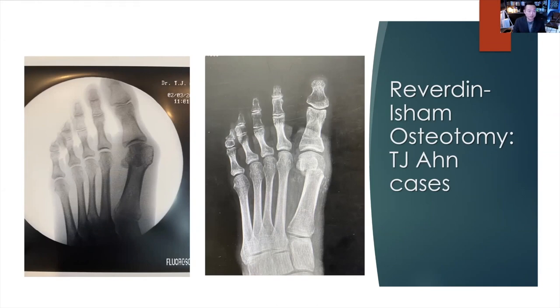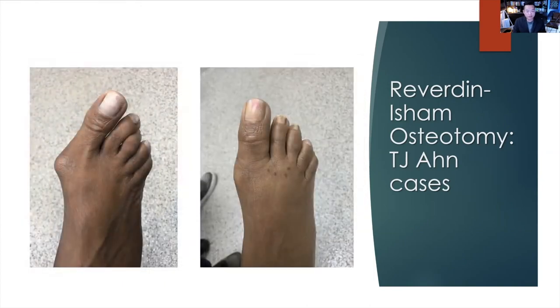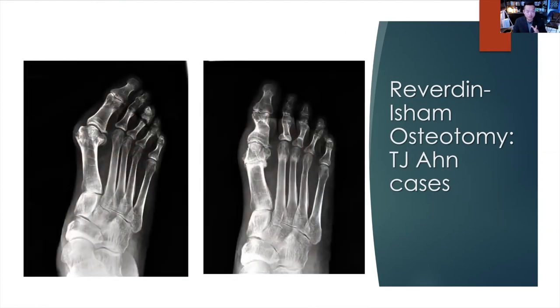Here's another case, before and after. This one, I believe, clinically looks beautiful. If you look at the x-ray, traditional open surgeons would say, oh, that looks crooked. But again, I don't know what else you would have done with a traditional open approach. The patient was turned down other than for lapidus or first MTPJ fusion and arthroplasties of all the toes.